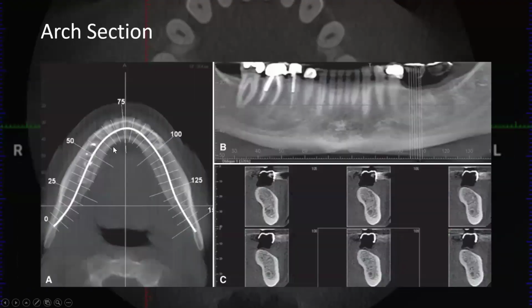And here's a mandibular site. Again, your arch just follows the curve of the teeth. You want this oriented where up and down follows the direction of the implant. And then you can see the shape of bone, the height of bone, the width of bone. This one's somewhat S-curved, but it looks like there's a good volume of bone here, right? Probably adequate for implant support.